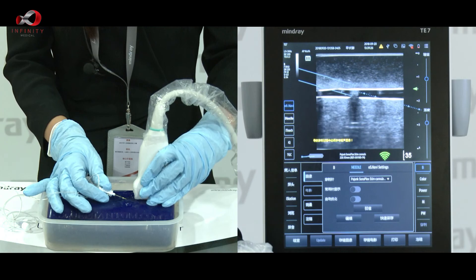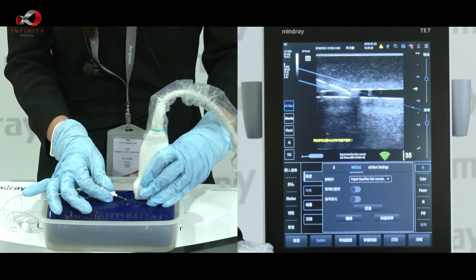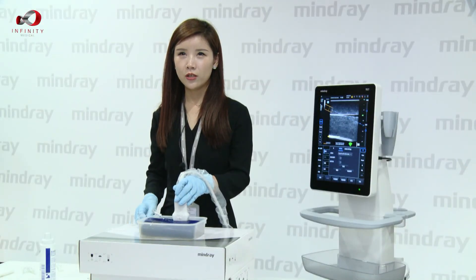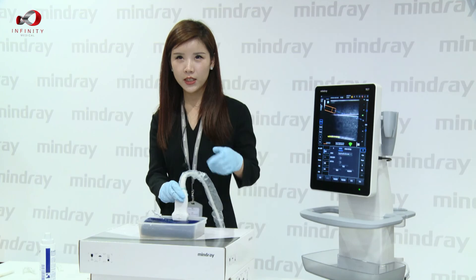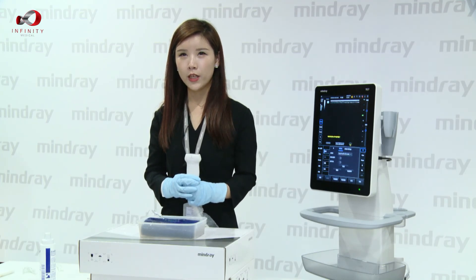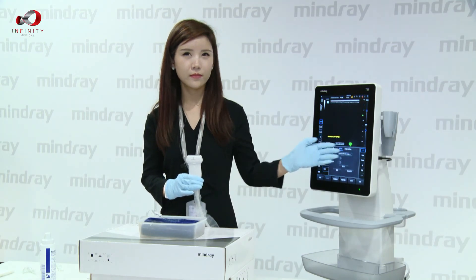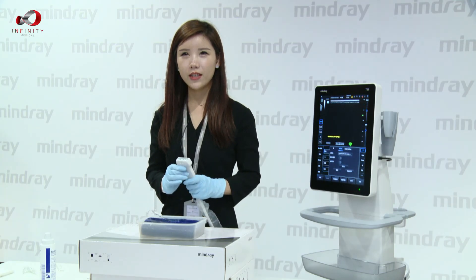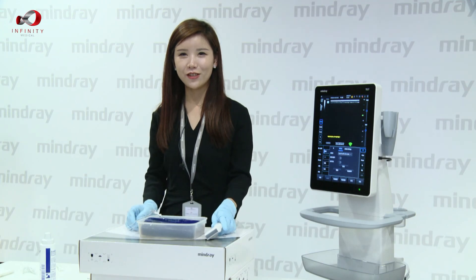For the whole process, we can see our needle very well. During the procedure, if the signal turns red, we just simply hold the probe up and wait for a few seconds, then you will see the strong signal show up again. That's all for the demonstration. Hopefully it's helpful. Thank you.